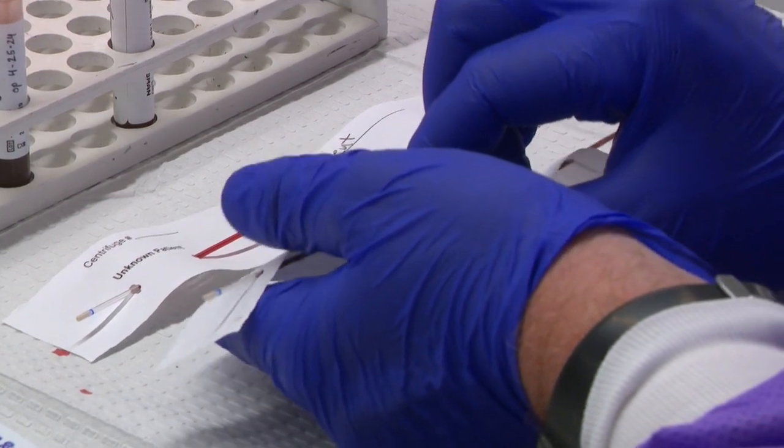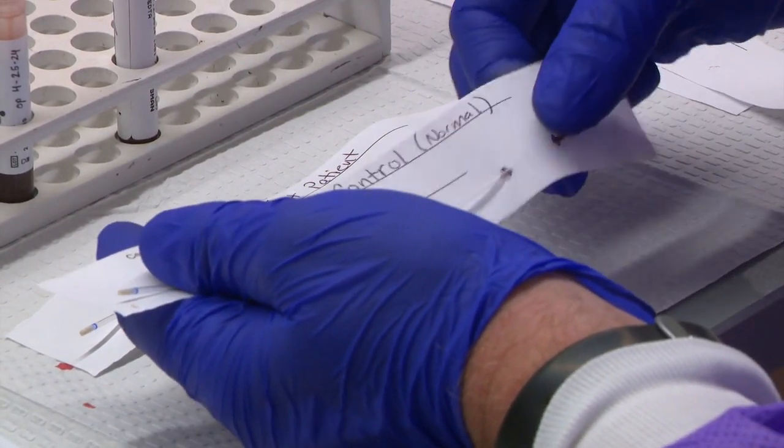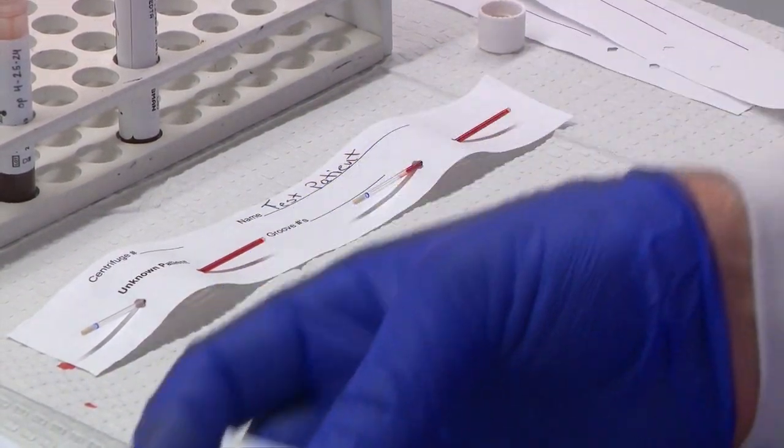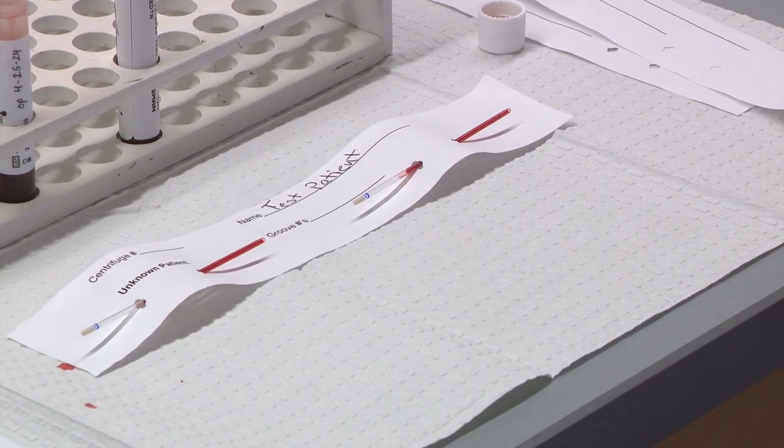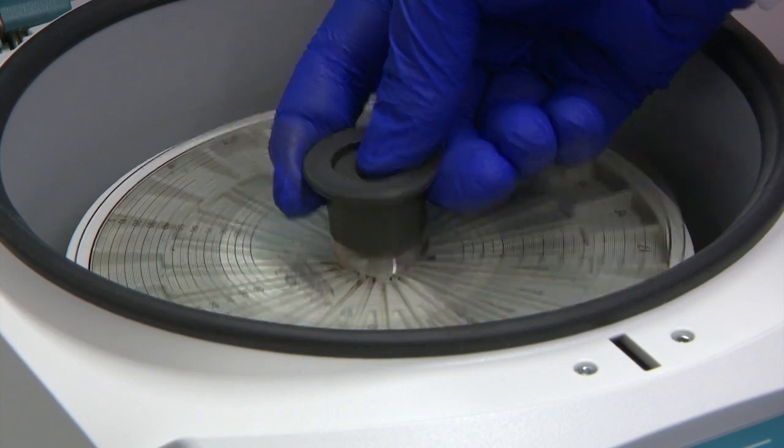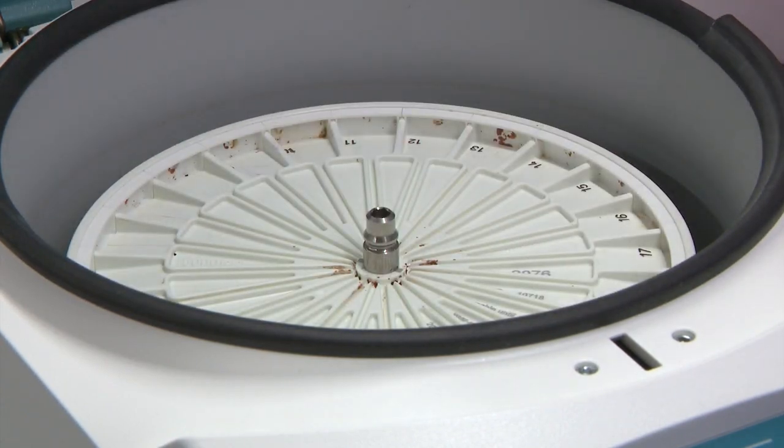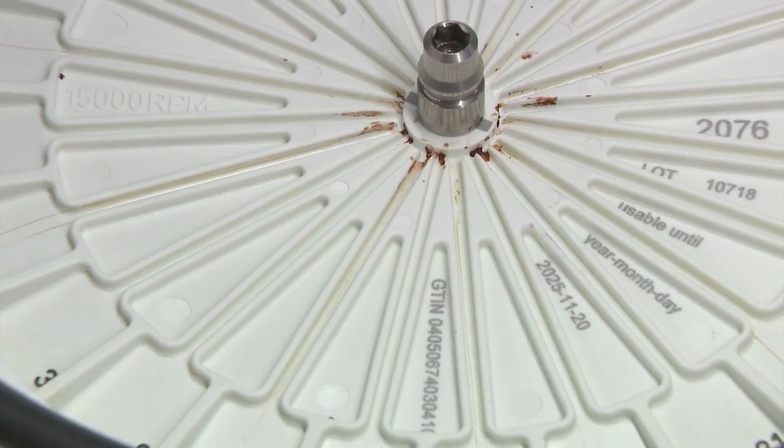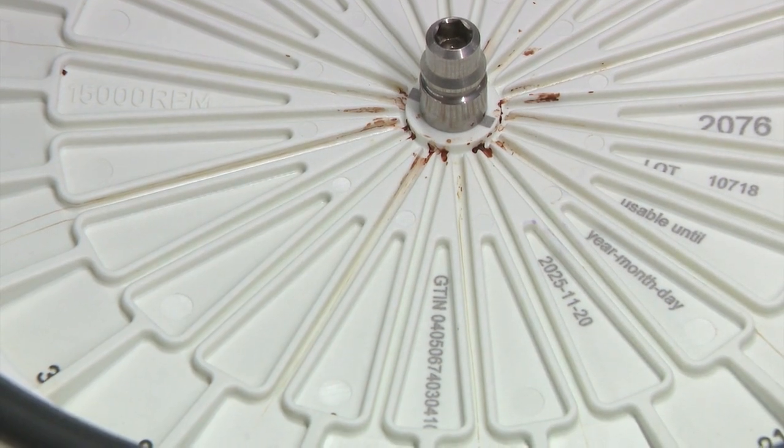Carefully transport the tubes to the centrifuge area, making sure to hold onto the sheet and the tubes with your fingers so the tubes do not slip out. Open the centrifuge and remove the lid. Notice that the centrifuge has grooves. These are the grooves that you will place your micro hematocrit tubes in.